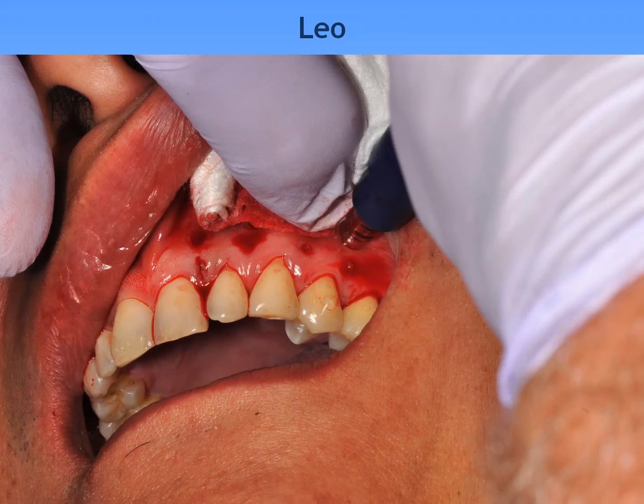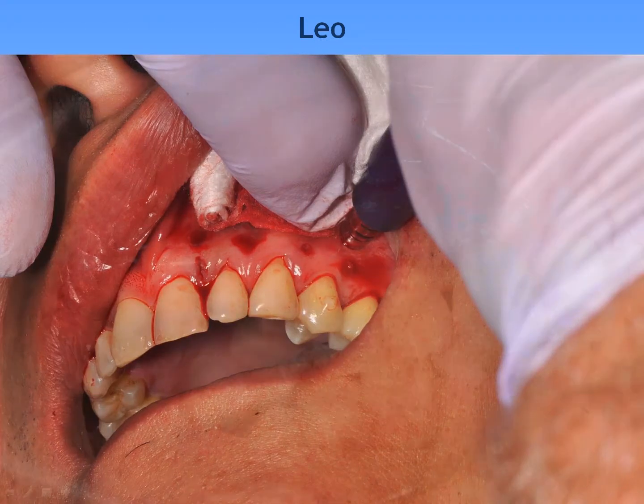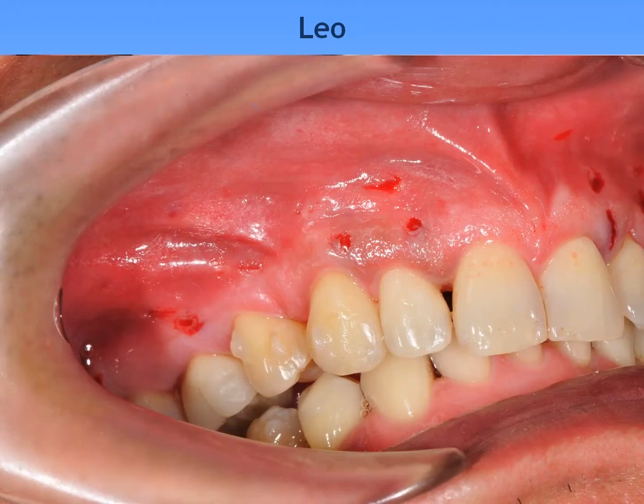But the same idea, that's typical, the amount of bleeding that you see. It's not a big deal, it wipes off, you're all set. I want to show you something also. If you look over on the far right side of the picture, I put my arrow on it right now. That's a place where I was placing a lot of force, and I actually skipped the little burr right through the papilla.